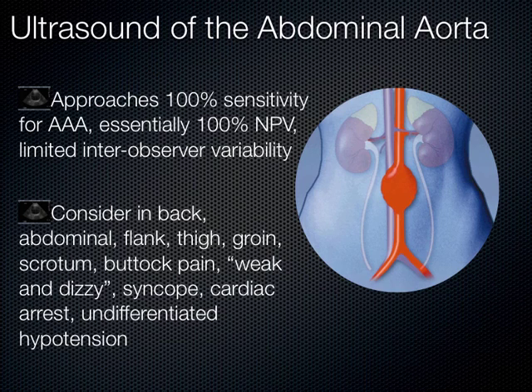This is not the case for appendicitis. That's very difficult. These are on complete opposite ends of the spectrum, okay? DVT, aorta, way over here, very easy. Last week, appendicitis, challenging, okay? Very operator dependent.